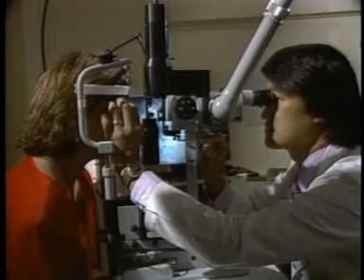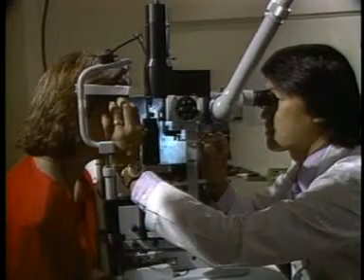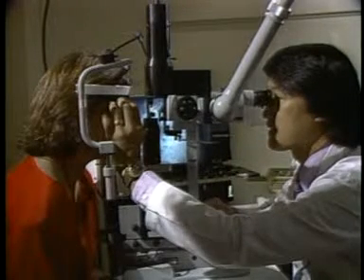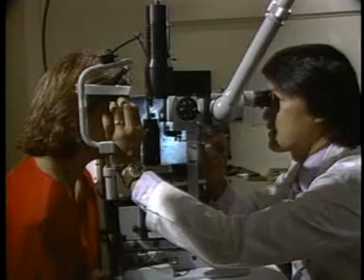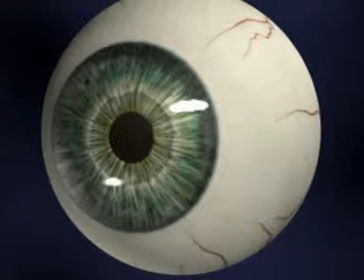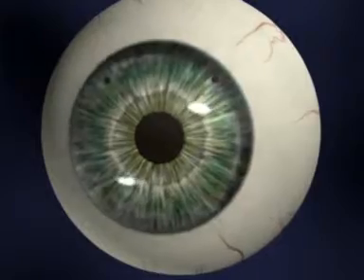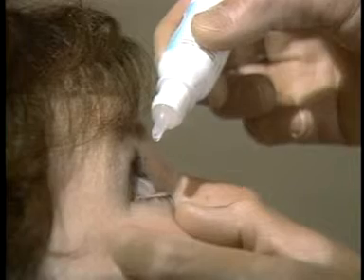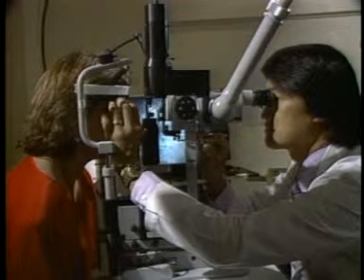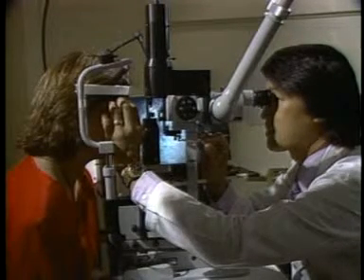It is suggested to utilize an yttrium aluminum garnet or YAG laser, or a 2-step laser procedure by pre-treating with an argon laser followed by neodymium YAG PI. Two PIs should be placed superiorly, 90 degrees apart in the mid-periphery. Each PI should be at least 0.5 mm in diameter. Typical post-laser treatment medication includes prednisolone acetate 1% drops 4 times per day for 7 days. It should be noted that these procedures generate the most patient complaints.